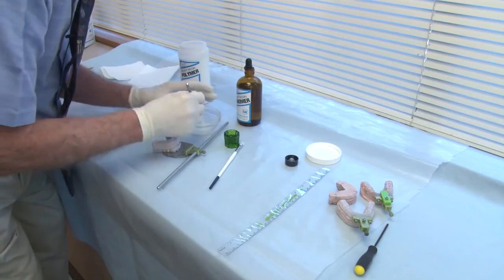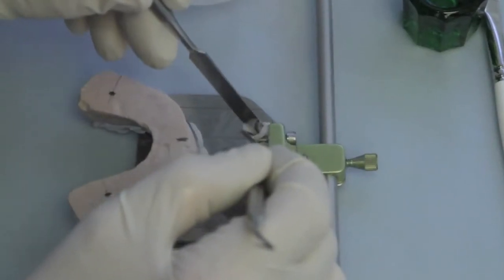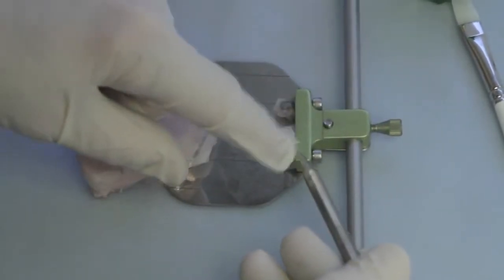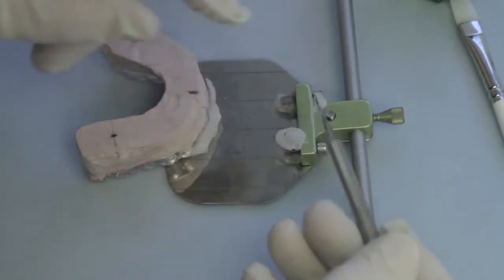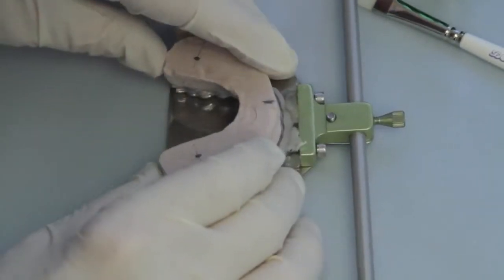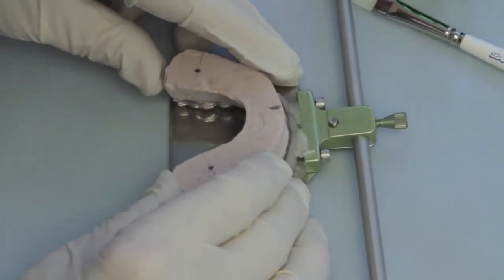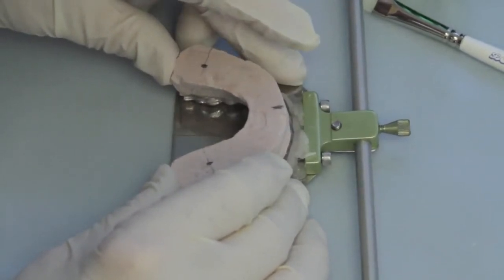And now I want to add some to the screws, making sure I get the screws surrounded good. Now I want to center the model, move it in again so that the screws touch the biacryl, and center it, looking at the first molars.